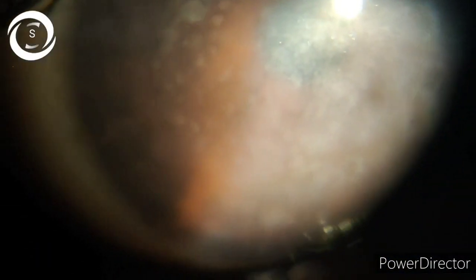These white dot-like opacities in a dirty gray confluent cornea, and the patient was 35 years old, female, who gave a history that these lesions have been present since childhood and very slowly and gradually increasing in size, and her vision is gradually deteriorating. So that tells you that it's a case of corneal dystrophy.